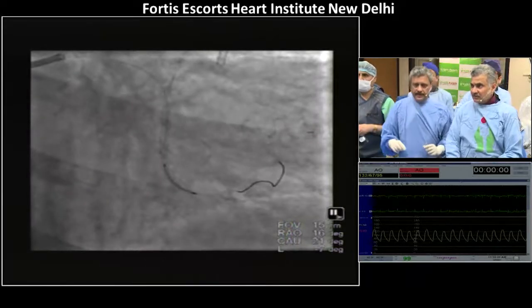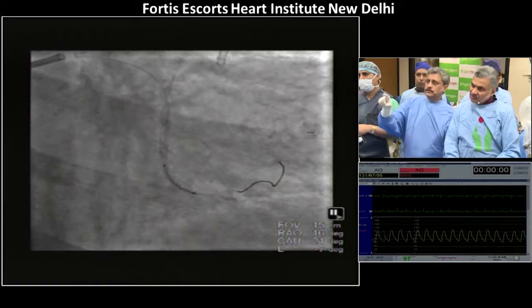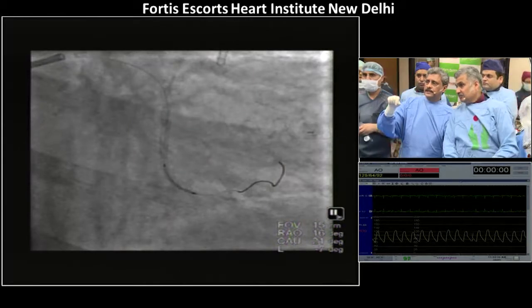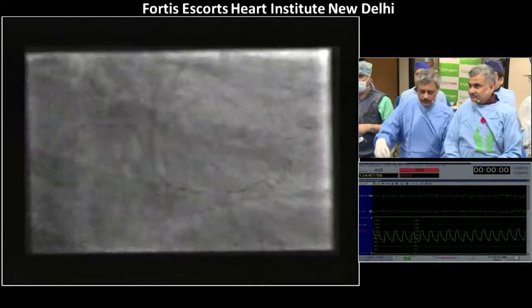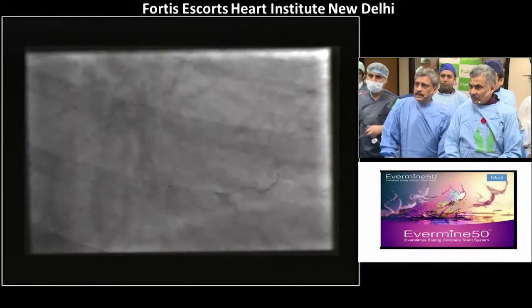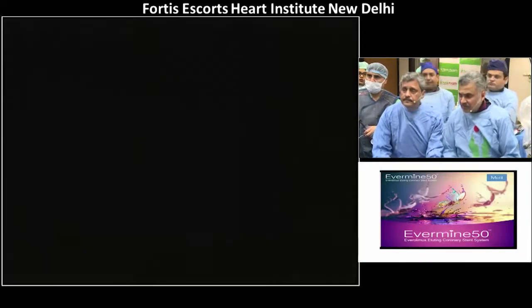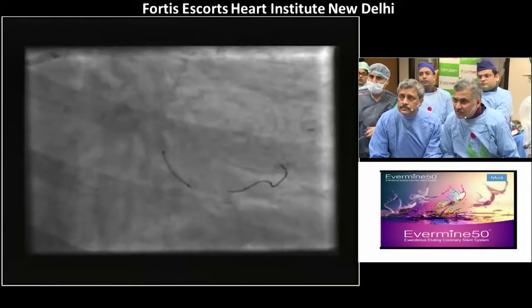We want to give a very fine overlap over there. No, this is the old stent. Probably we need to come back a little, 1 or 2 millimeters. Agreed with you. Yeah, I'm coming back. All right. So there we are, on a cine. Check.